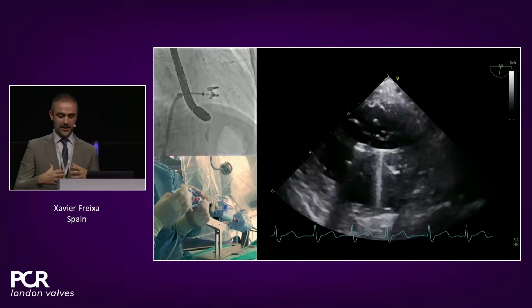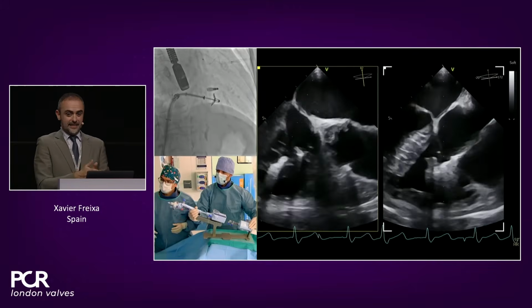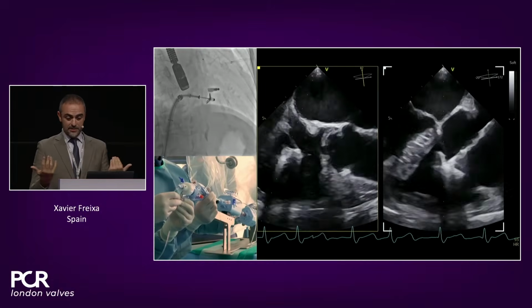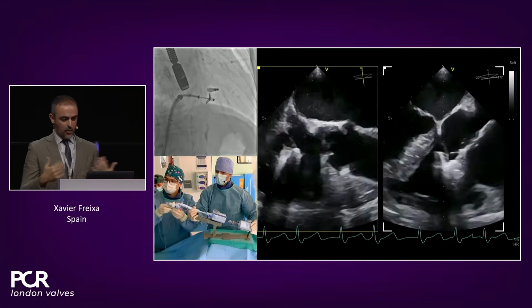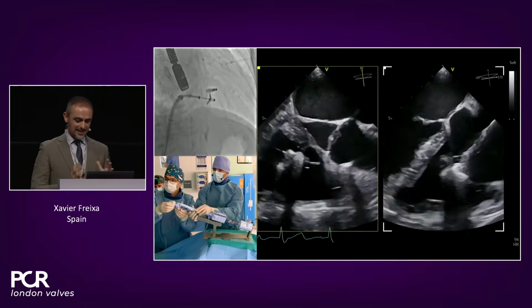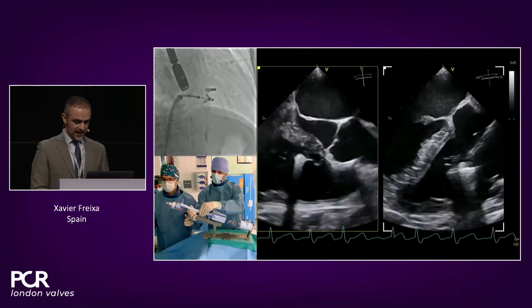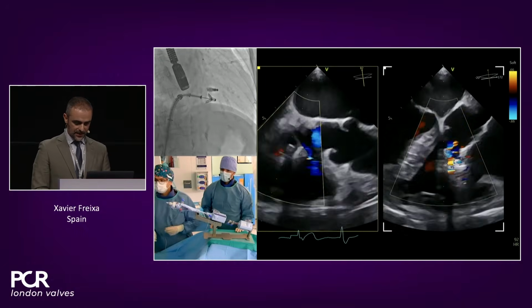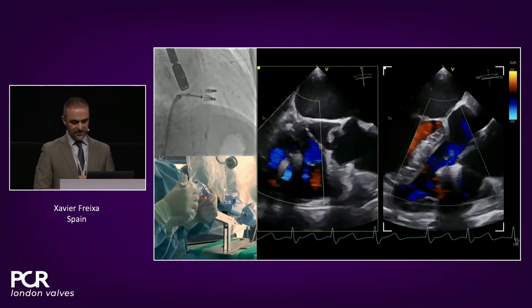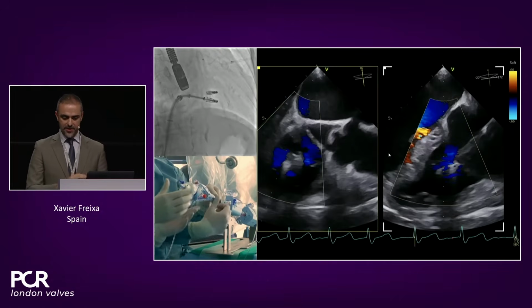So, message: color reduction is not always telling that you have a good grasping, okay? It's just that with a clip, you're stabilizing the septal, so it keeps the septal up, so then the coaptation is better, but it's not good. So then we open the clip again. We're trying to get both leaflets. Here you can see that the septal is in, but not so much in. And here, you'll see that we're closing a little bit, and now it looks a little bit more away from the first clip. And now the result is superb in terms of color reduction.